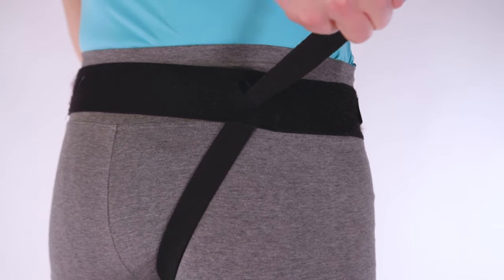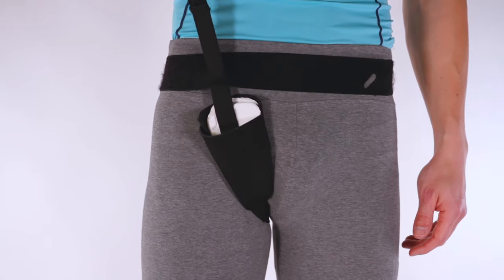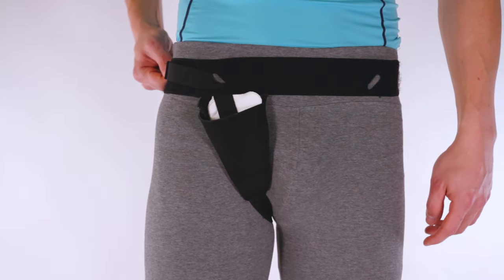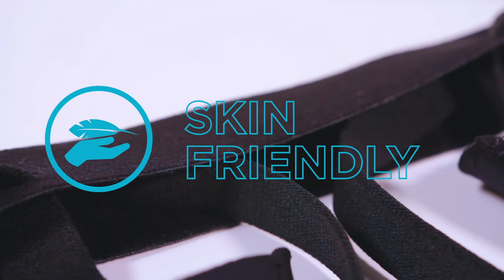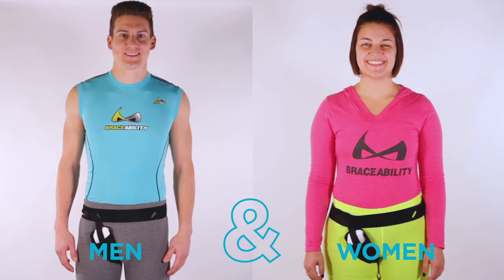Adjustable tension straps allow you to position the anatomically shaped compression pads directly over your hernia. Breathable, machine washable, skin-friendly material. Fits men and women.